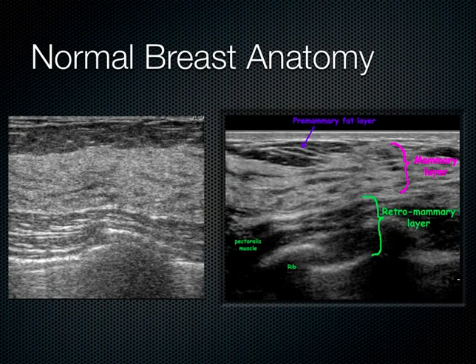Now, the normal breast anatomy is very simple, and like most glandular tissue, it has this very typical layer. So we can see really three main layers here. This is layer number one. Here is the subcutaneous layer. This is just sort of subcutaneous fat here. And then, like all glandular tissue that we've seen on ultrasound so far, the thyroid, the testicles, things like that, it has this sort of appearance, relatively, I would say, isoechoic here, with the different lobules of breast tissue here. So that's called the glandular layer.